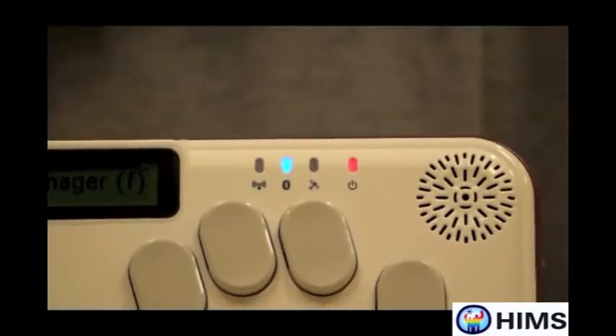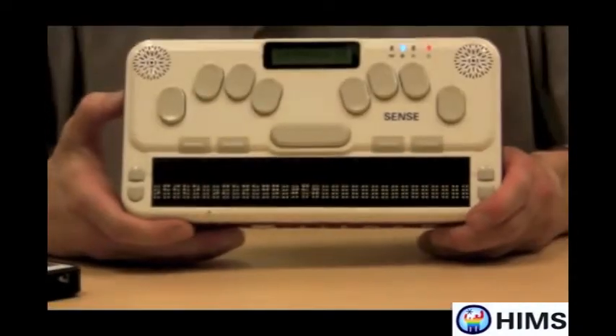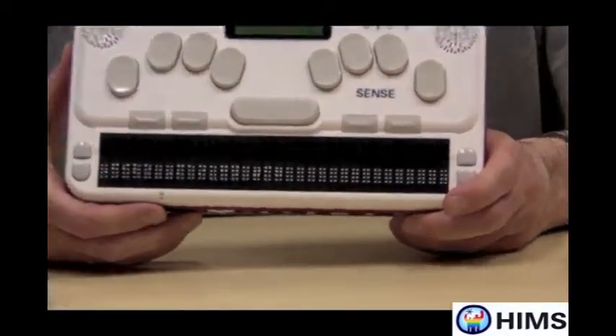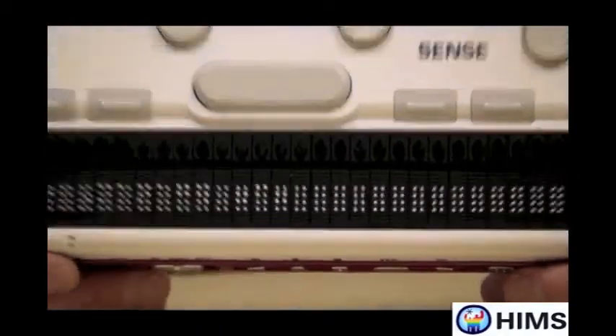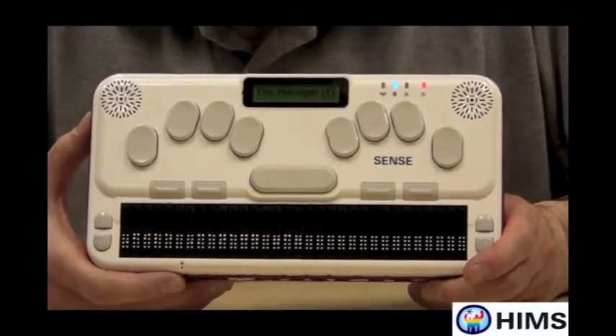It's also the wonderful note-taking device that hopefully you have grown to love in the past. It has 32 cells of Braille, it has a full keyboard, and it has many other features such as internet browsing and email access.